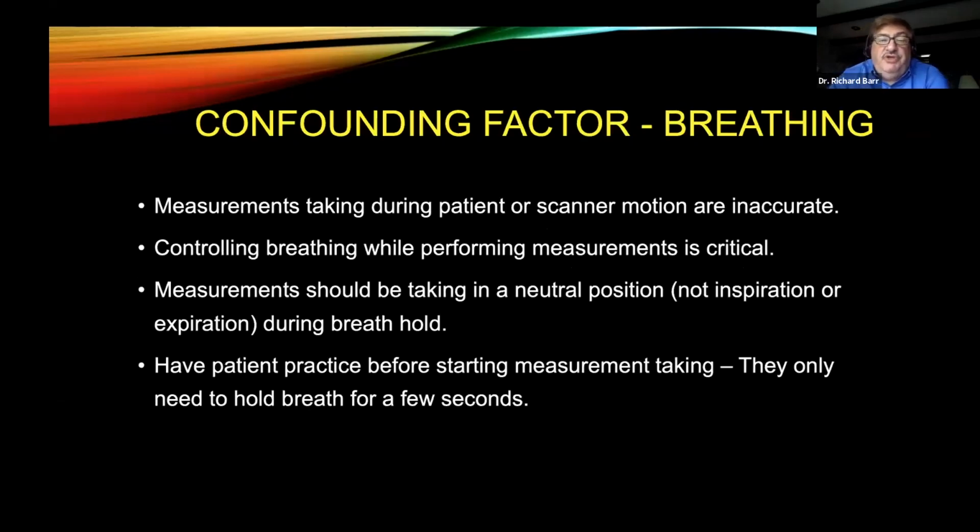I think particularly when you're starting, one of the hardest factors is breathing. We know that measurements taken with patient or scanner motion are inaccurate. The shear waves are only generated over a few millimeters, so very small motion can cause erroneous measurements. So we want to control the breathing while performing these measurements because it is critical to get accurate measurements. We should be taking the measurements in a neutral position, so not inspiration or expiration. Again, this is because we change the right heart pressure, and that is transmitted to the liver. So when we do a Valsalva, the liver actually becomes stiffer.